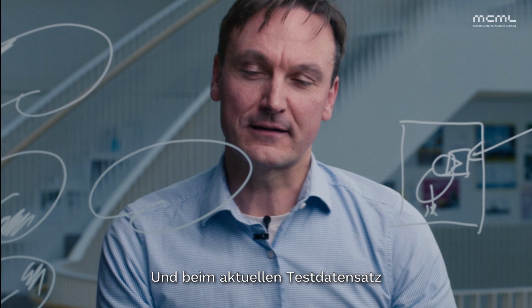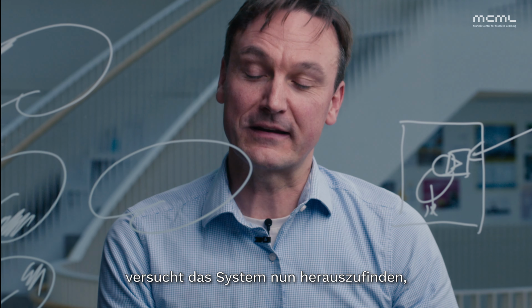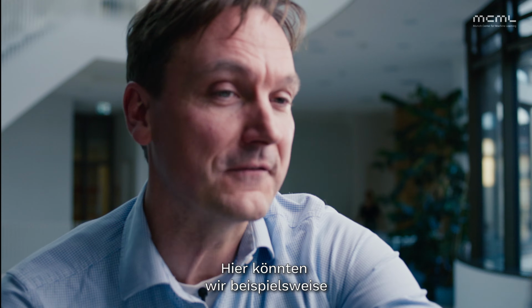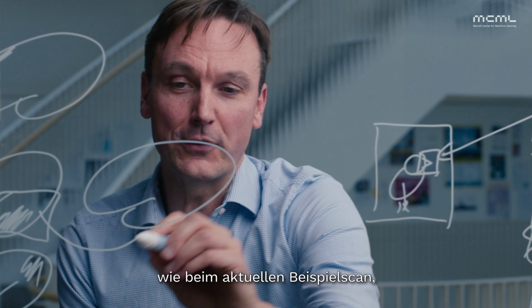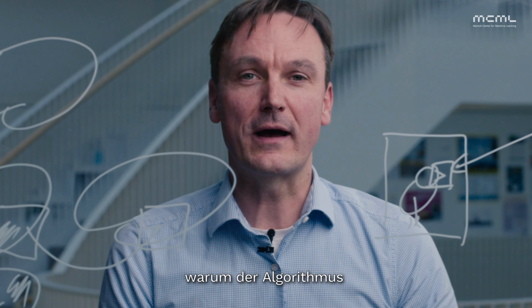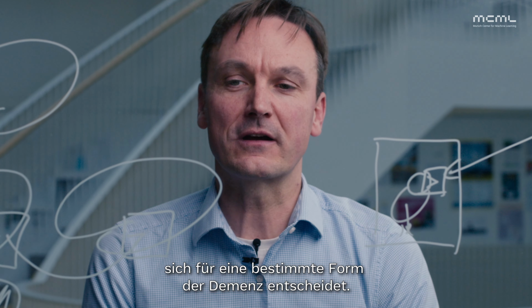And now for the current test subject, it is trying to identify which one of those is actually best matching. So for instance, here we may have this pattern in the temporal lobe also in the current test image, and this would then give a justification as to why the decision for a specific type of dementia is made by the algorithm.